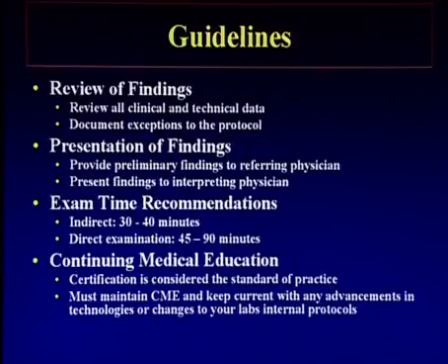Following that portion, you will be finishing the examination, and the next section will guide you about the review and the findings themselves. You want to make sure that you have all the clinical and technical data before the patient leaves the room, as well as any exceptions to your protocols. Then you want to make sure that the presentation of the findings is appropriate for the interpreting physician and the referring physician.